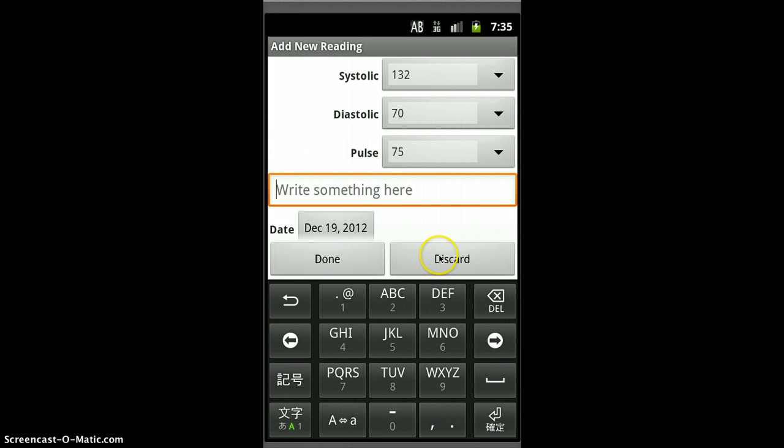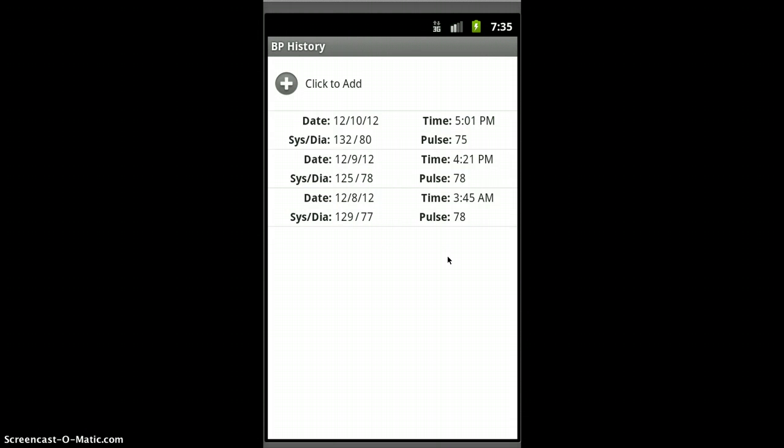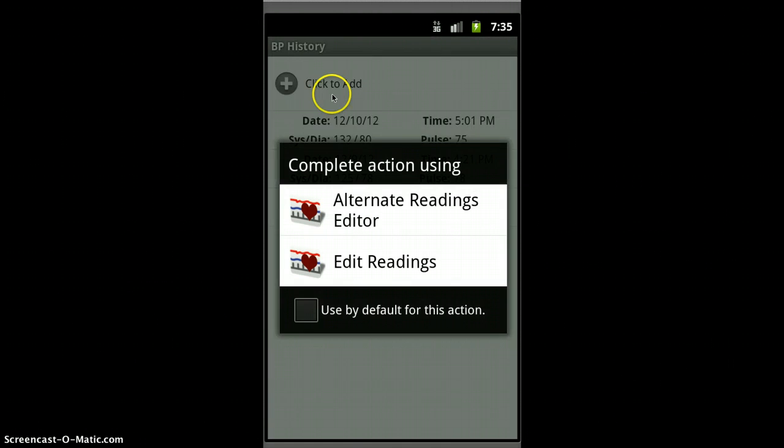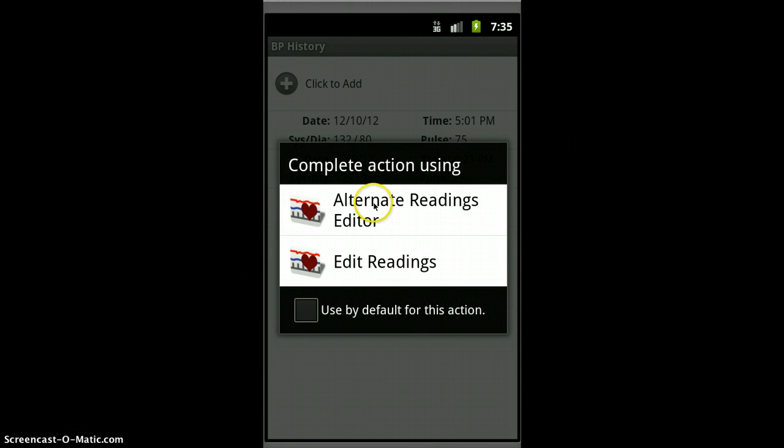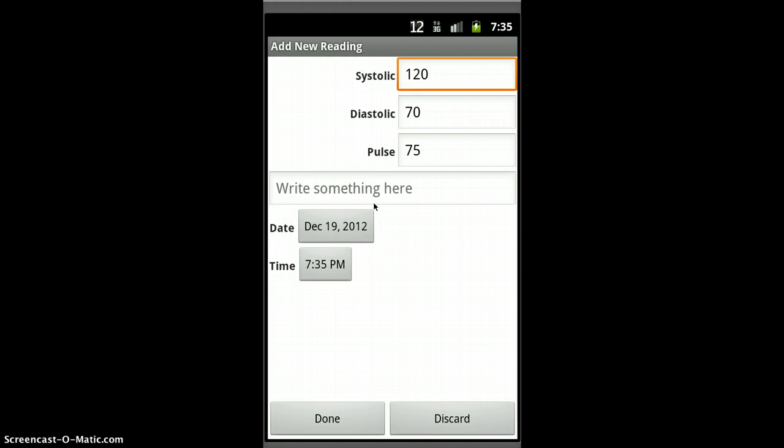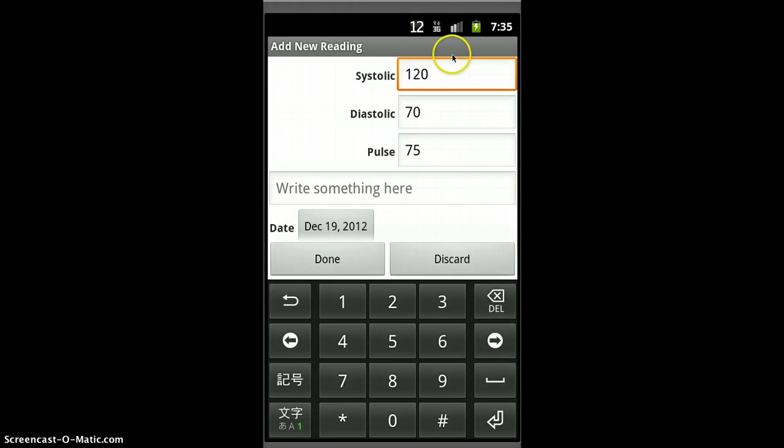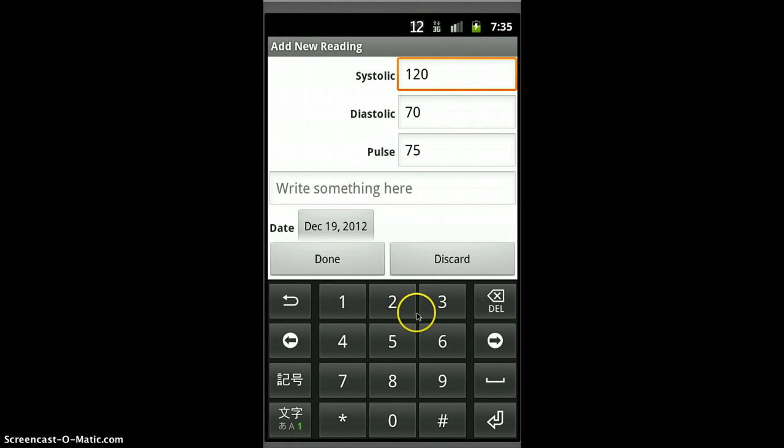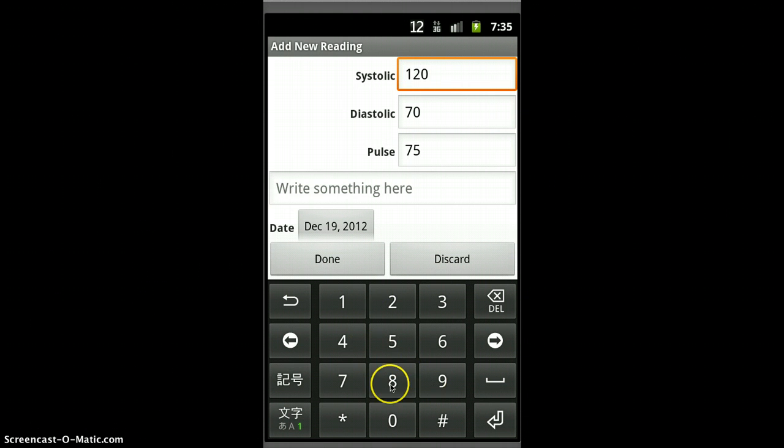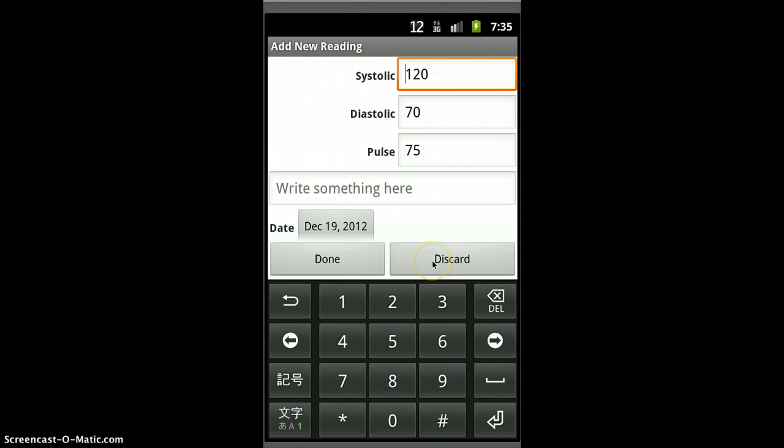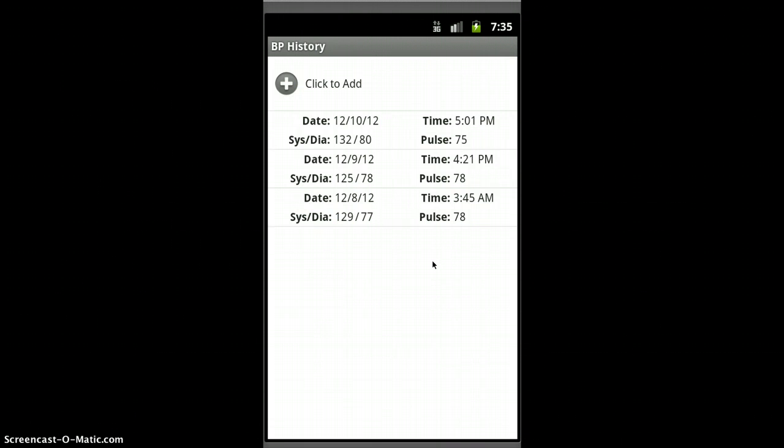We can discard this one, and we'll try adding again, and we'll use the alternate readings editor. In this one, you can type in your values. So in my case, because I don't have a keyboard here, it comes up with a keyboard. I'll discard that one also.